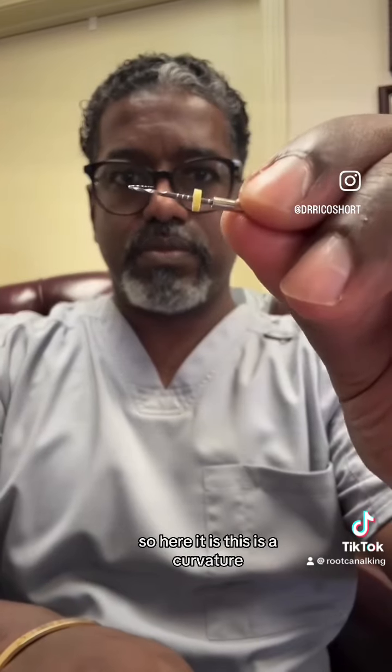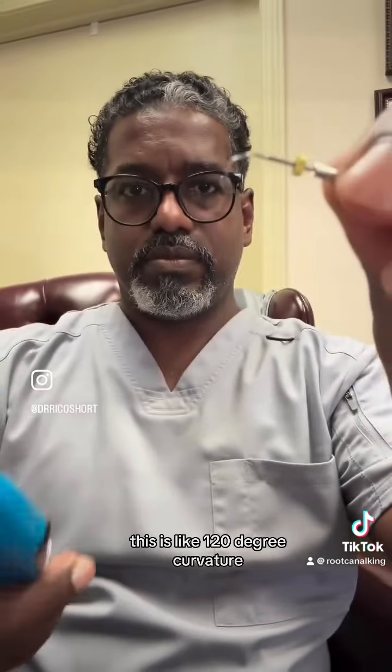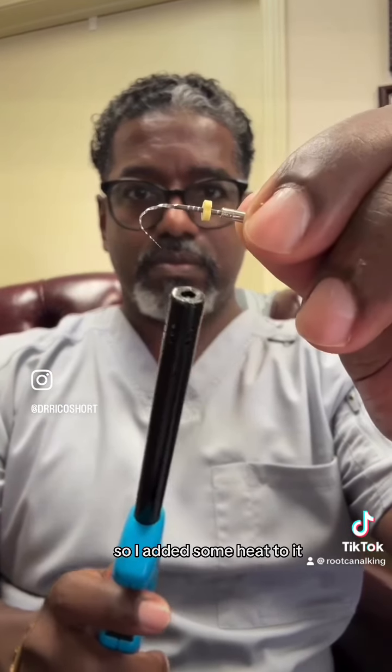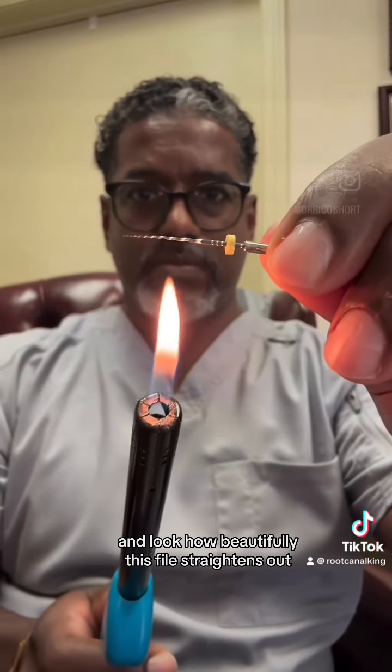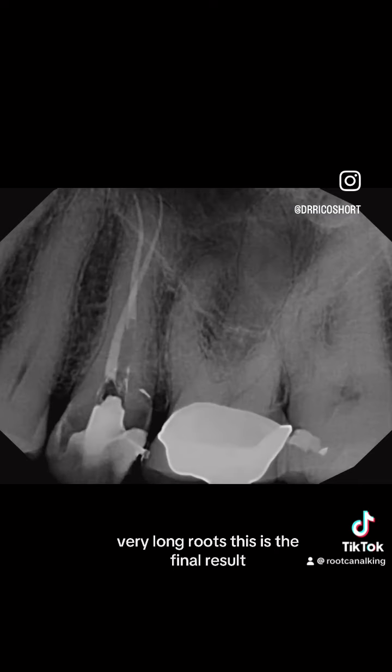So here it is. This is a curvature. This is over a 90-degree curvature. This is like a 120-degree curvature, and I want to see how it performed inside of the canal system. So I added some heat to it, and look how beautifully this file straightens out. Very nice. So I'm confident to use it in very complex cases like this, very narrow curved canals, very long roots.